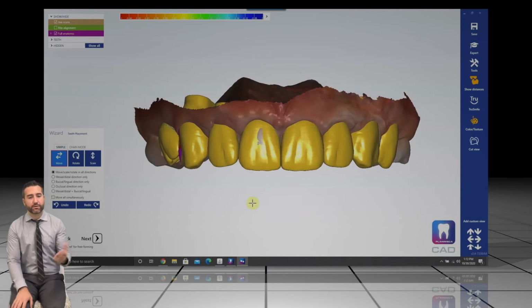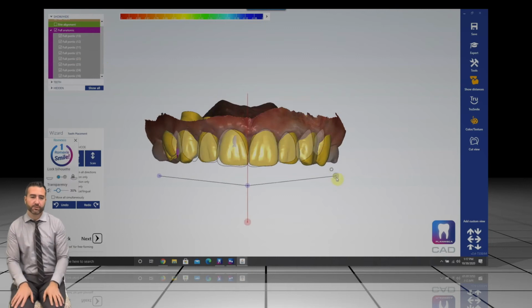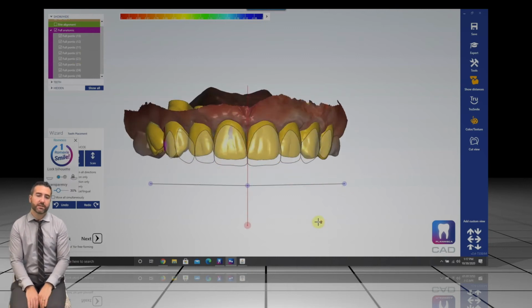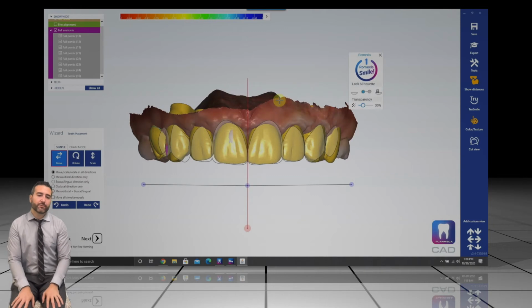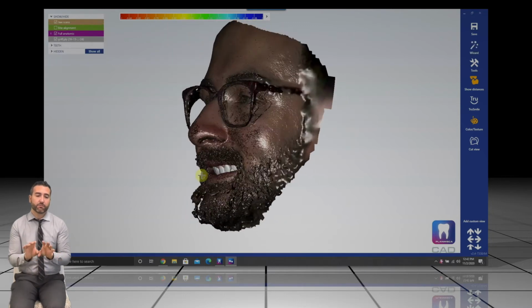And of course, you could throw on any kind of smile design software that you work with, and you could overlay that to get your proportions right. Also, you could use the intrinsic smile design software that's built into this particular program, which is really powerful as well. And what you're able to do from this is severalfold. You could either 3D print shell provisionals, or mill or print snap-on smiles to show the patient, or you could 3D print a monolithic model.